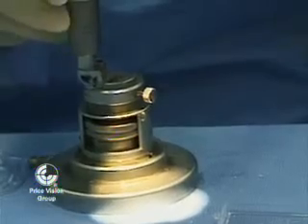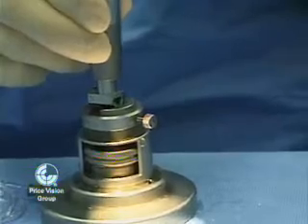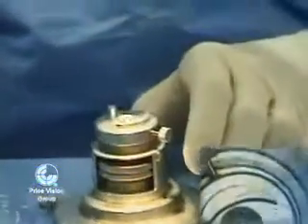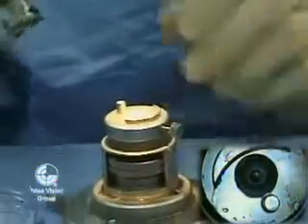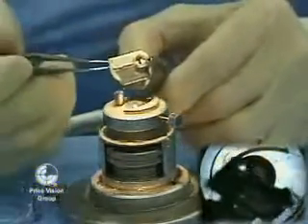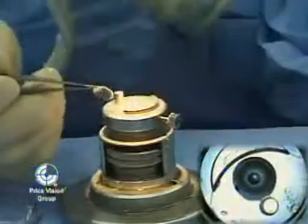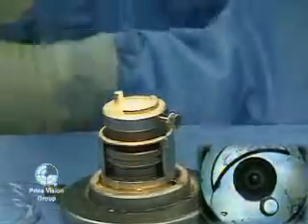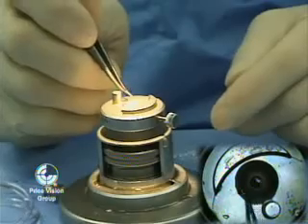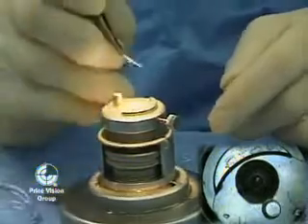After inspecting the blade, we're going to engage it in the track, and we're now making the resection across the cornea. As you can see, it makes a nice, smooth, even resection. The resected piece of cornea has now been removed from the microkeratome. I'm placing it back on the surface of the corneal tissue, and we're going to line it up to match with the gentian violet mark that was placed earlier.